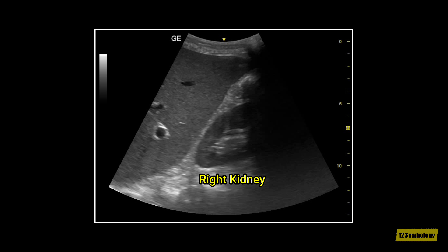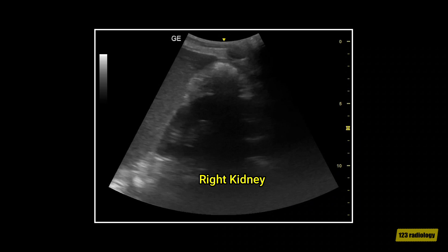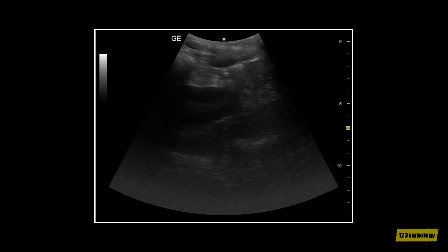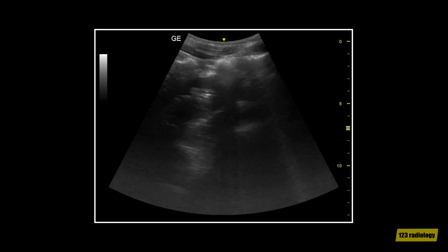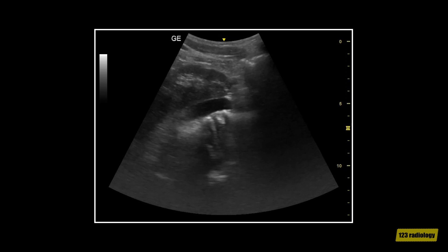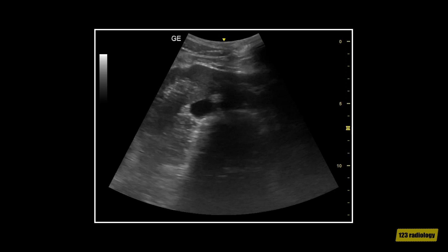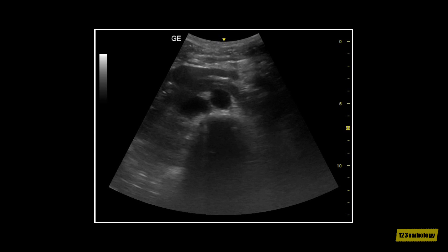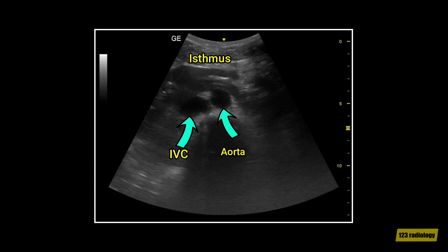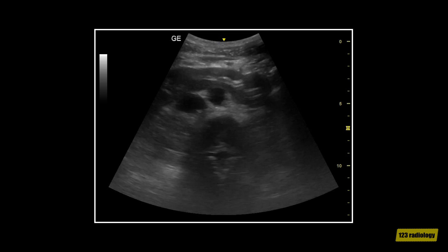This video clip shows a case of horseshoe kidney. As you can see, this is the right kidney. The lower pole of the right kidney is endless as we continue scanning. This is a transverse view of the aorta showing the isthmus anterior to the aorta and IVC.